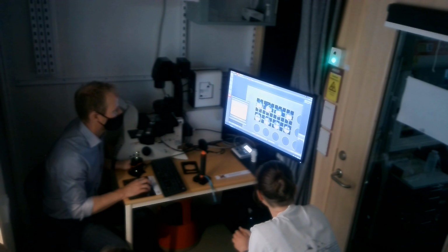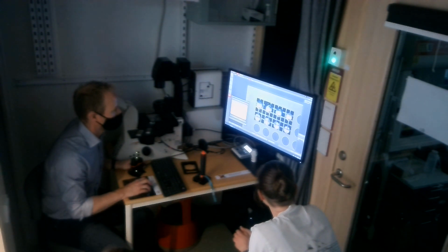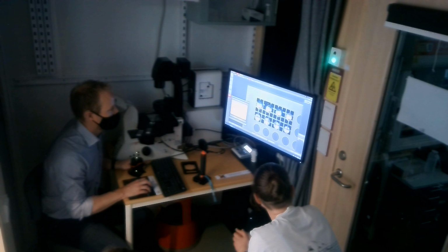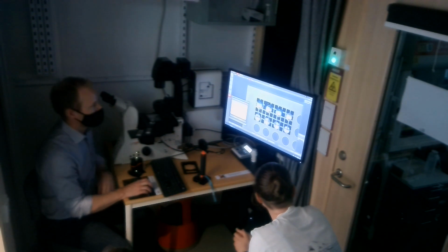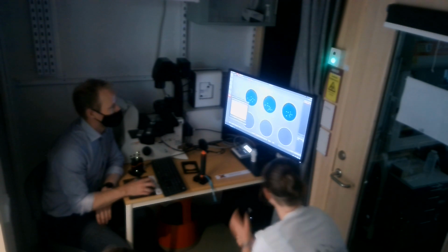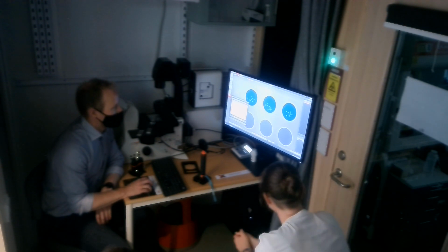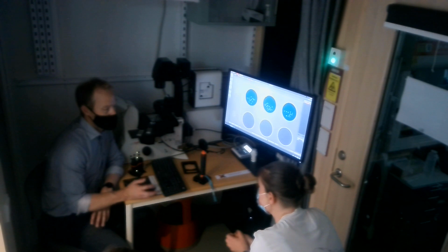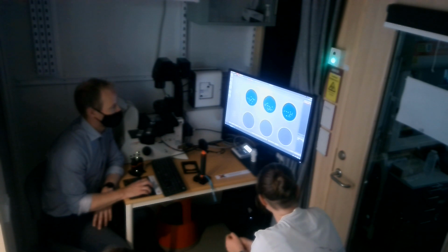I will just move these down. So we get a test drive anyway. And I'll take this away so that we can see it. Okay, so with this, and then I would probably do focus map. How many you would need, it would be very different. So what I will do is like that.